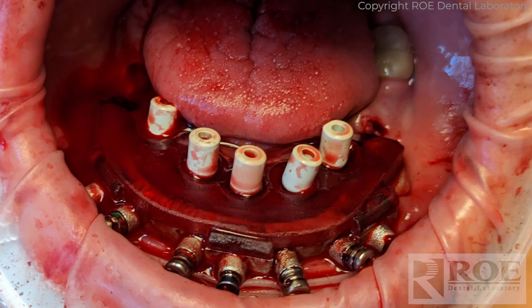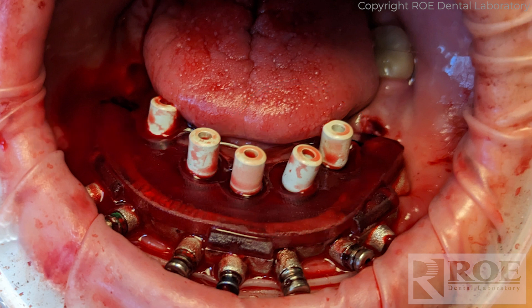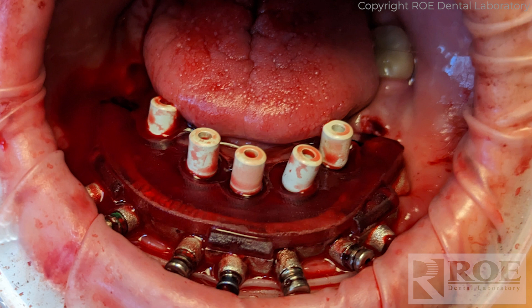The handles come out and the scan bodies go in — really just simple healing collars. We work with many different healing collars on the market. You'll seat these and then seat the carrier guide. These particular ones are the protective caps for screw-retained abutments from Straumann. We have this library, which directly correlates back to the OptiSplint and will be digitized. You must capture the facial of the fixation base to reference back to the original scan from the day of surgery.